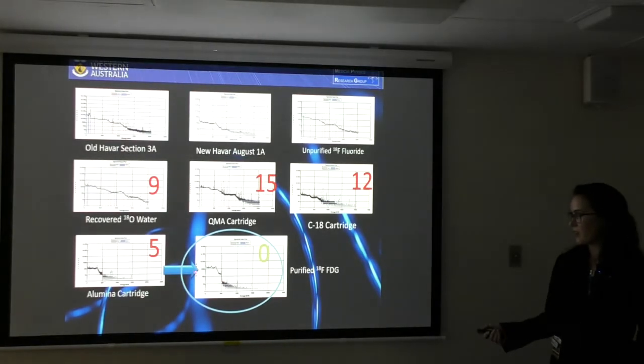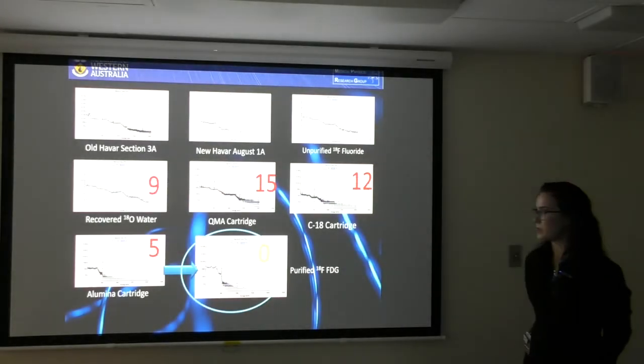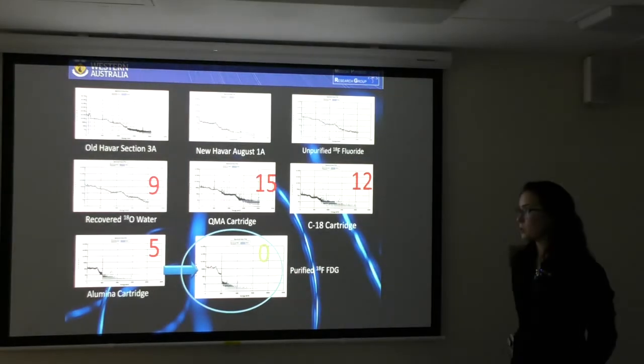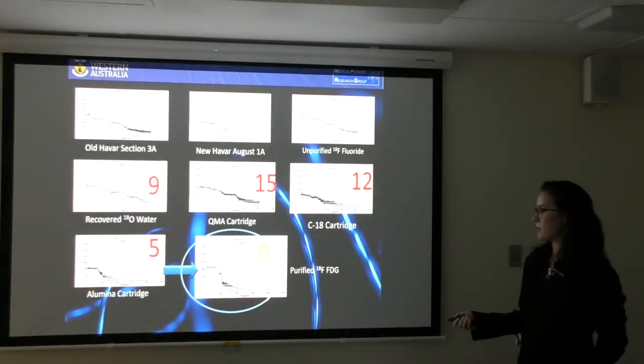You can see in this spectra that we do have some peaks at the lower end. This is because we have the Compton edge and Compton backscatter. This is natural, we should be seeing this. We also have some peaks in the lower end at 72, 75 and 85. These are not to worry because they're just characteristic peaks from the lead shielding. We also have some peaks in the higher end.